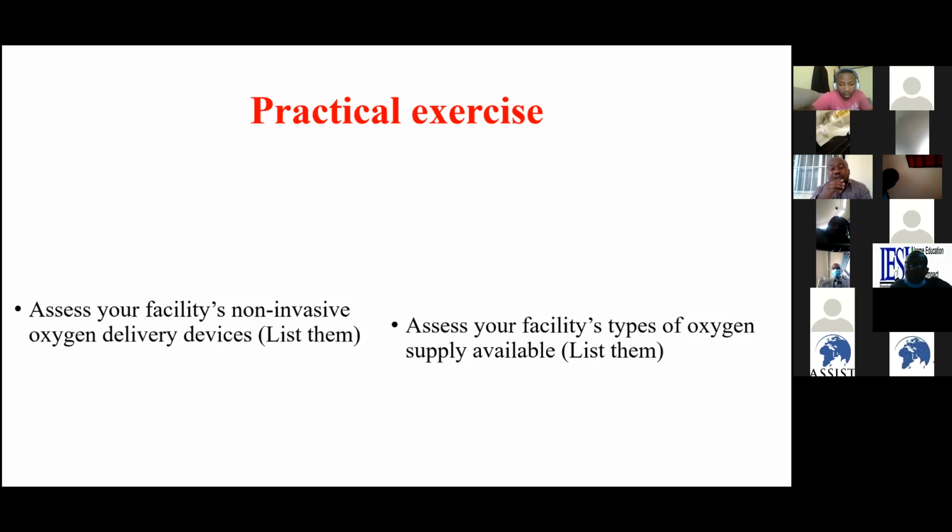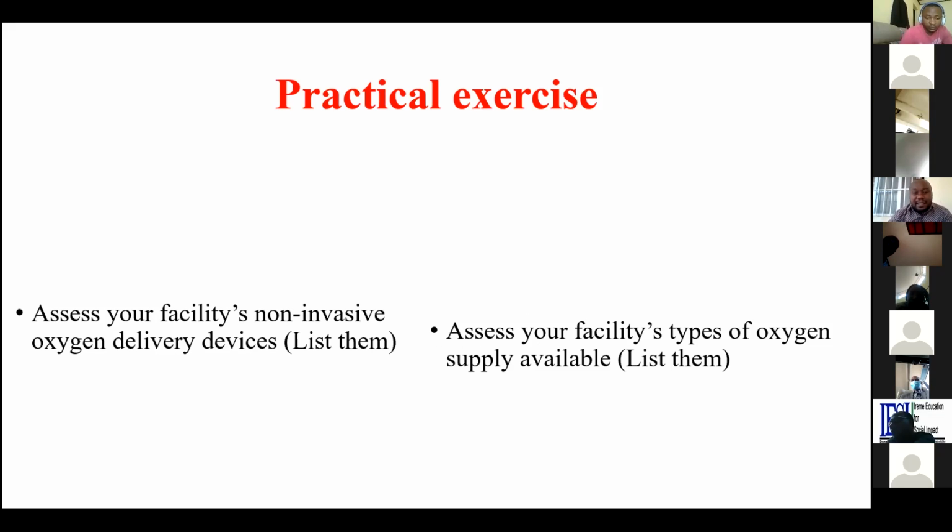And at that time, you will see most of these patients who are having this facial mask with reservoir, but which is not full, as Dr. Paul was saying, will start to sweat because the CO2 will be much concentrated in the mask, and they're not receiving the oxygen because you give less. From this, you are not helping the patients. You have to think when to use a facial mask with reservoir and when not to use it. And when you need it, please give appropriate oxygen.